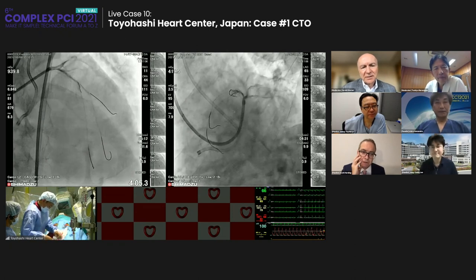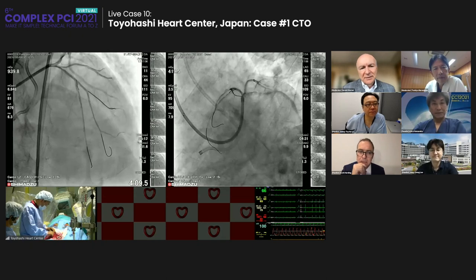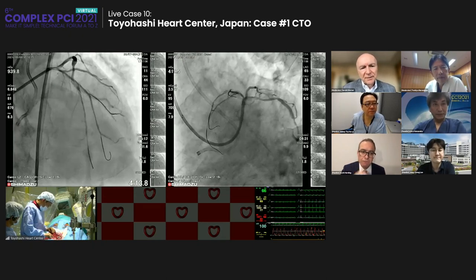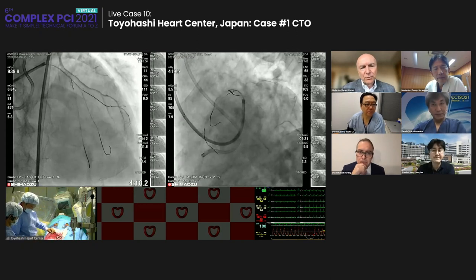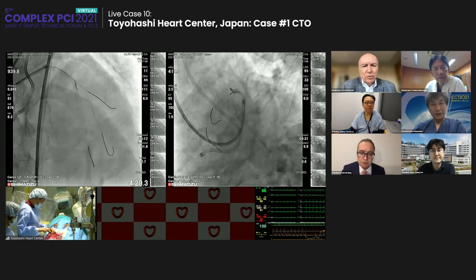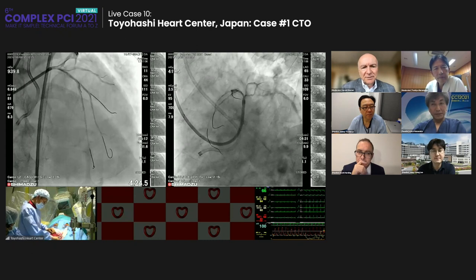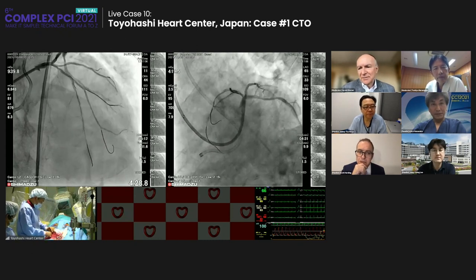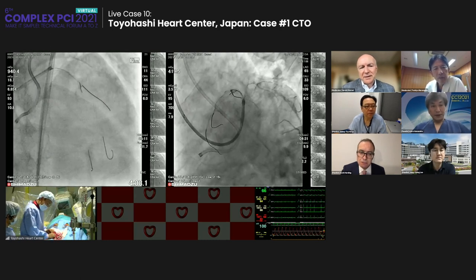I think the vessel is pretty big, actually, where the stent deformity is. You could go to 3.5, even maybe more, and there's enough room. I personally would, as Scott has also favored, think culotte is a feasible option. It makes it cleaner afterwards.